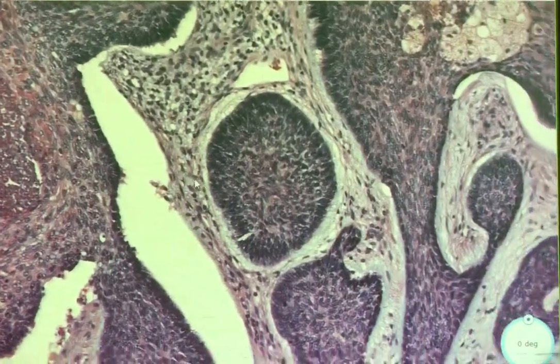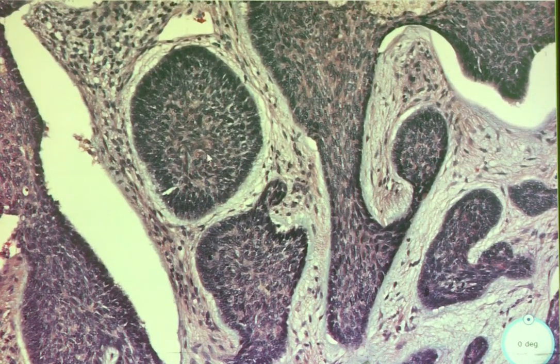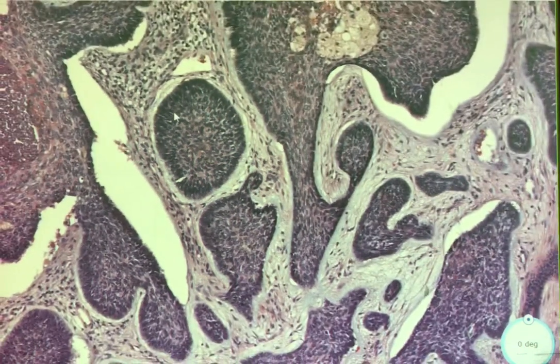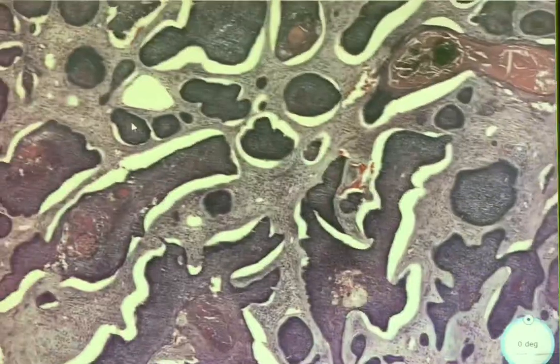Okay, so it's really distinct. It's almost arranged. It's kind of beautiful. This is more like a biphasic kind of appearance. This is more like columnar, like palisading. Yes, it is palisading. Palisading means that it goes around the periphery, almost like a fence. And it's obvious in all of them. And the middle is more like polygonal cells. So it's biphasic.